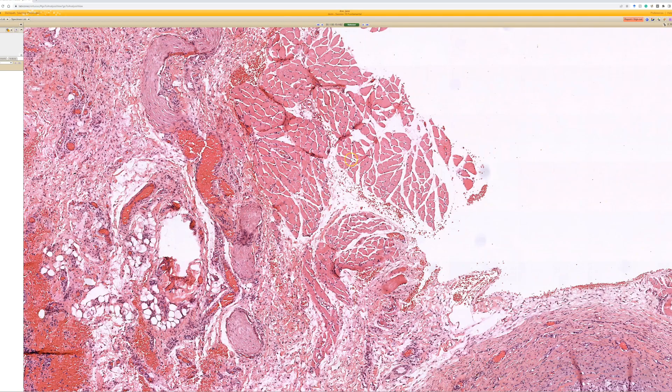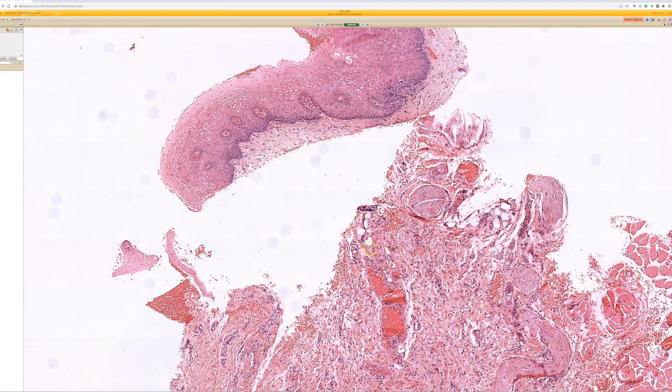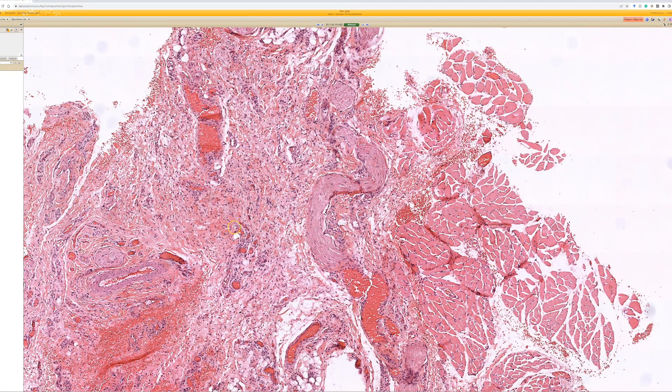If instead of skeletal muscle we had smooth muscle bundles here along with squamous mucosa, then we'd probably be in the vagina or the labia minora.